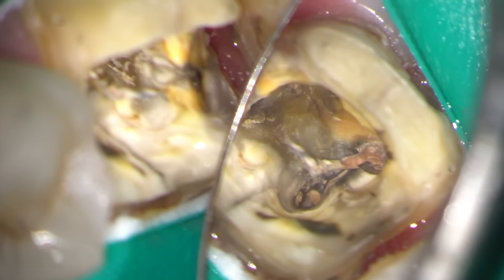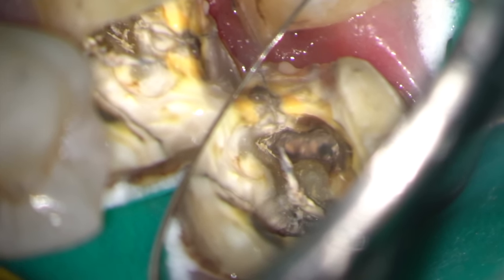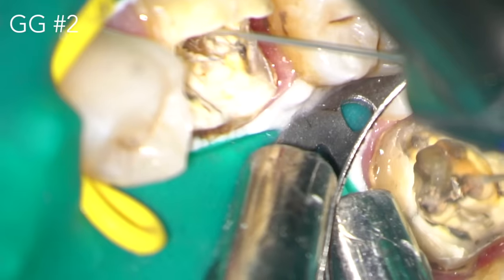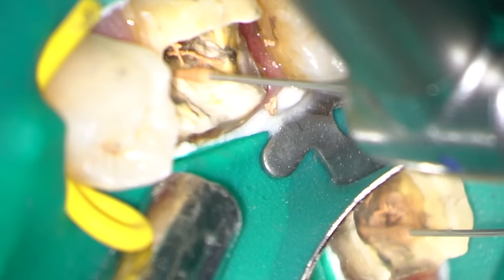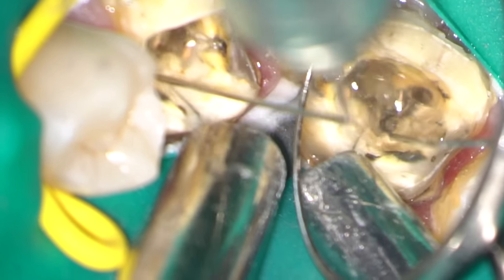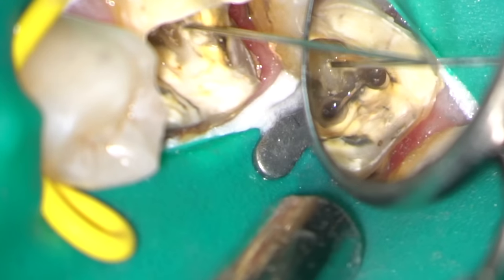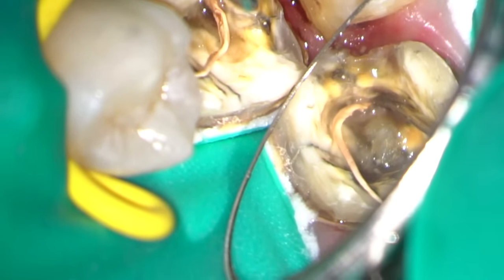Everything's looking a lot tidier now, and we're looking under high magnification at the mesial canals and then focusing in on the distal canal. I'm starting to remove a little of the previous root filling using a Gates Glidden burr number 2. I'm using a DG16 endodontic probe to remove material from the distal canal.